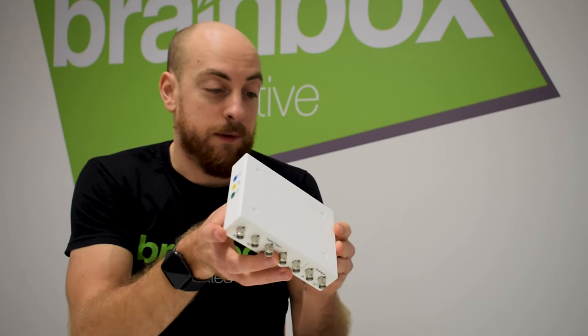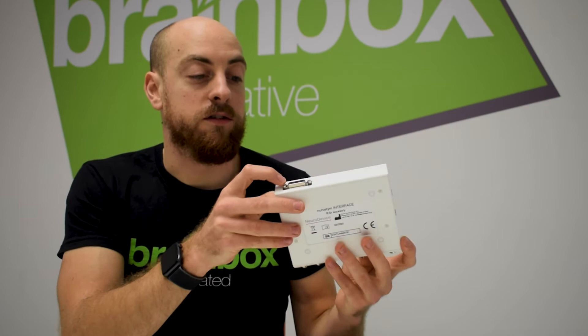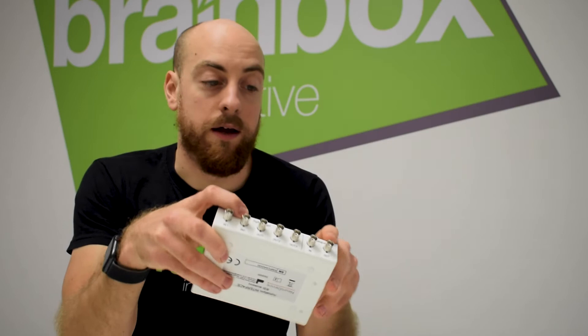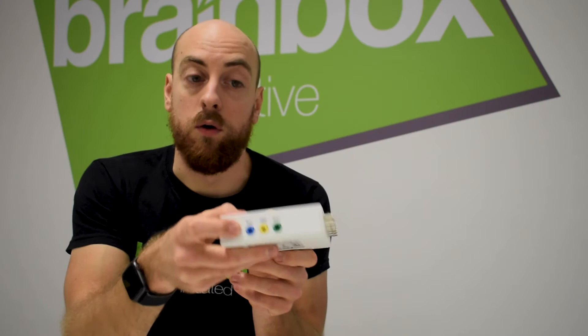Also in the box we have the new interface module. Exactly the same size as the stimulator hardware itself, the two are designed to be stacked one on top of the other. We have on the interface the receiving end of the 15-pin D-type connection. On the other side we have seven BNC ports for triggering and digital-to-analog conversion, and also three touch-proof connections for the low voltage signal.